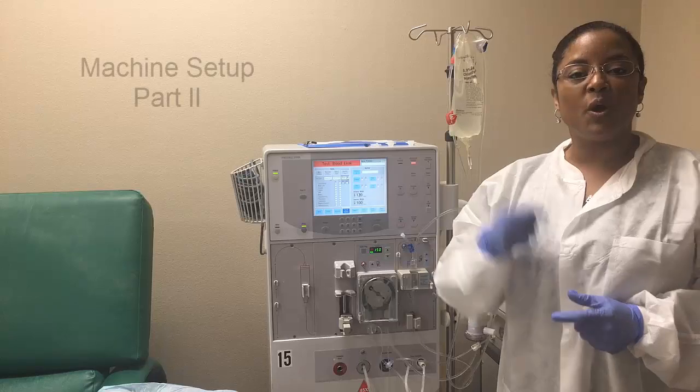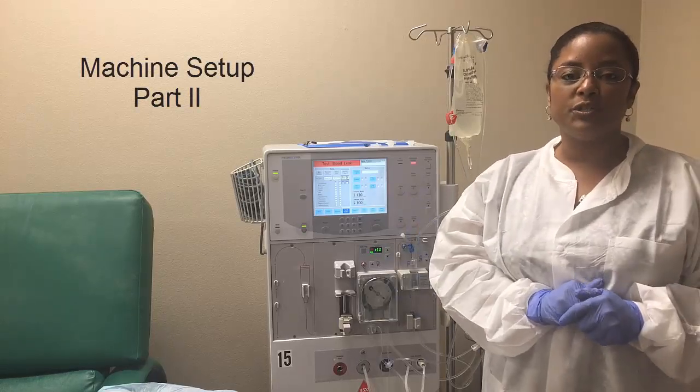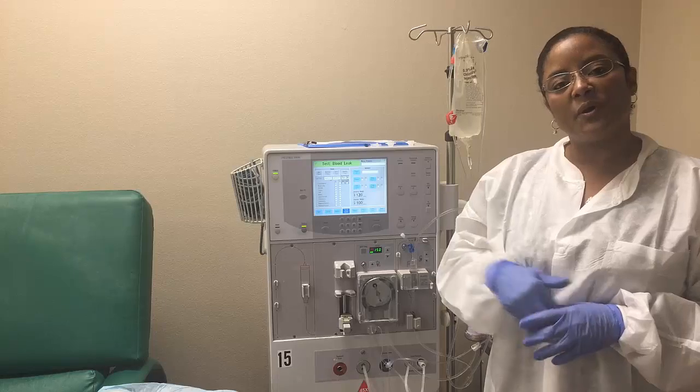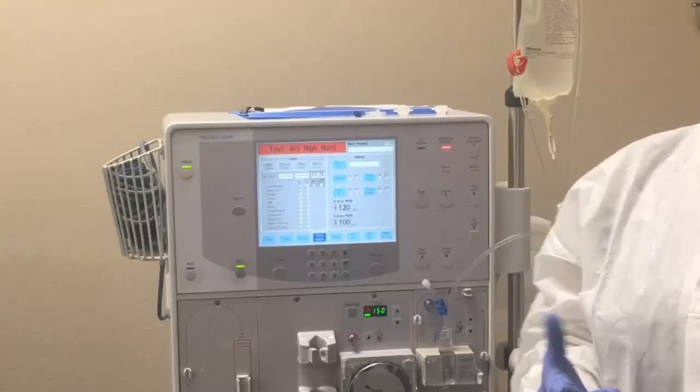So now this is part two of the machine setting. In the first part I showed you how to place your lines, prime them, and connect them together. Now in this part I'm going to show you how to start doing your alarms test. So let's start with that.